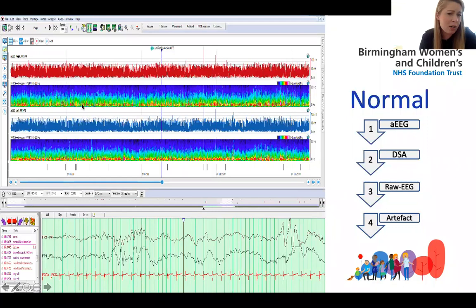What we also might see, if we were looking at the density spectral array, are some increase in frequencies with that corresponding increase in amplitude. And so you'd get some of the thicker red colours coming through here. And that colour-coded bar you can see on your main screen will remain above the density spectral array every time.